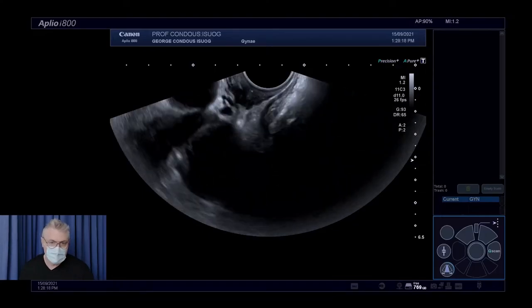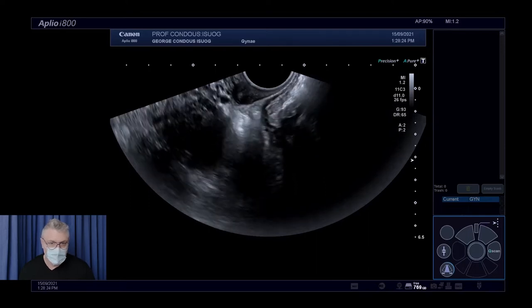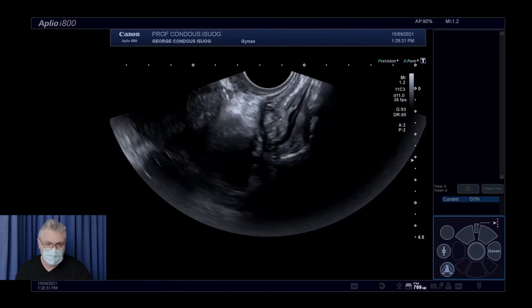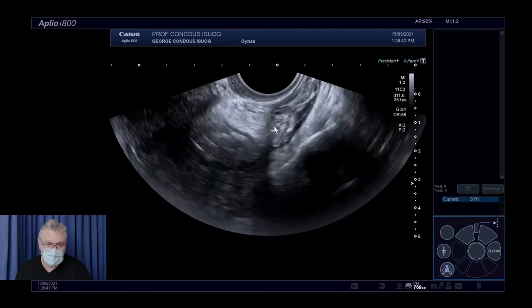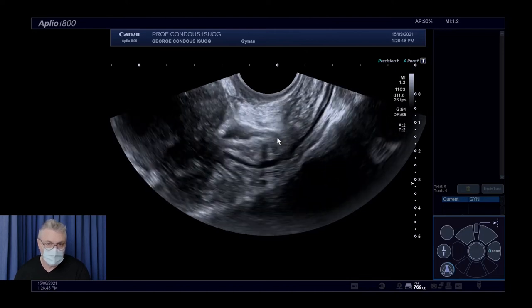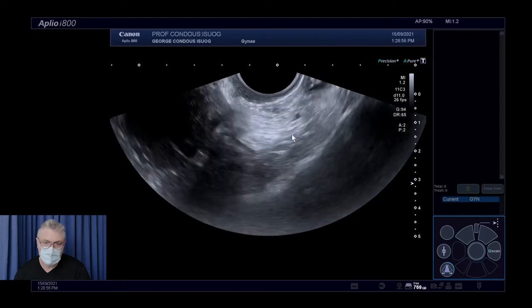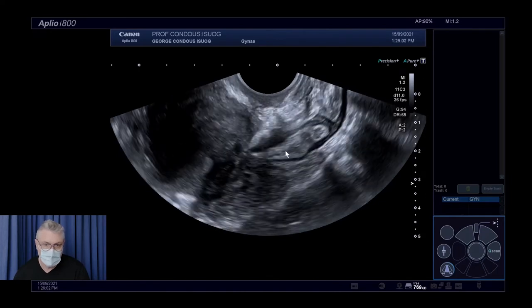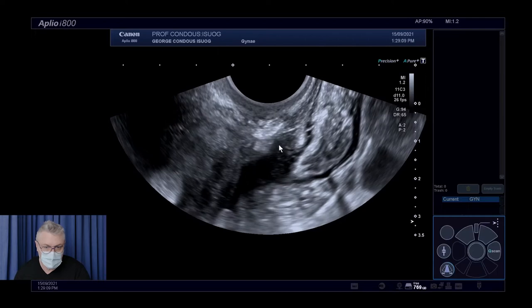At the start of the procedure, the probe is sitting just at the introitus with my hand pointing at about 45 degrees back towards the sacrum. My aim is to look specifically at the muscularis propria of the rectal wall, keeping an eye on it using a cursor to help focus. During this first part of the scan, we ignore the uterus and ovaries and focus directly on the rectum. Placing the probe just inside and ascending from the lower rectum into the upper rectum, we can see straight away the presence of an endometriotic lesion within the anterior muscularis of the rectum.